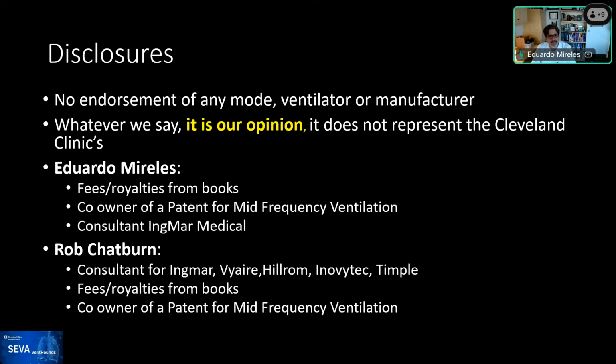And we know that these ventilators are a little bit funny because it changes colors, but you can see the S up here, which stands for a spontaneous breath, which tells you that it was triggered by the patient. There's some deflections on the pressure waveform. You can see the flow changing and crossing the baseline. And then you can see that it's cycled by the patient, by manifestations of the patient because of the peak flow to the end expiratory flow, and the inspiratory flow. And so you can see those different types of breath.